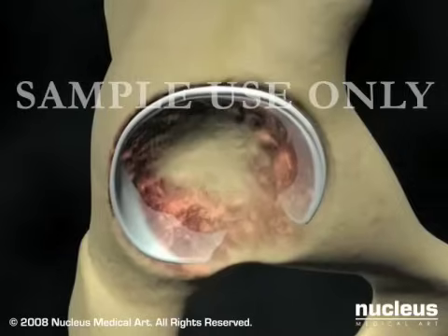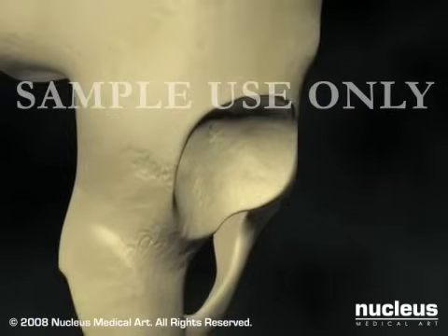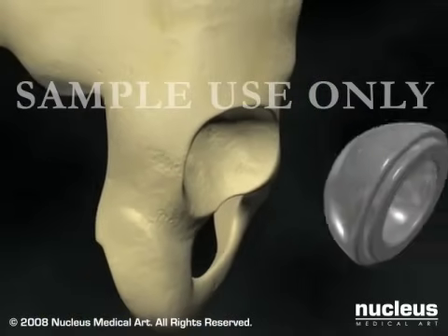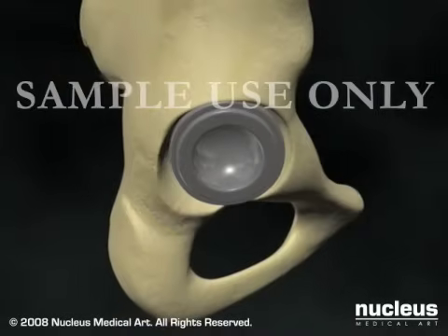Your surgeon will remove any damaged cartilage or bone in the acetabulum, reshape the acetabular socket, and secure the acetabular prosthesis in place using special cement or screws.